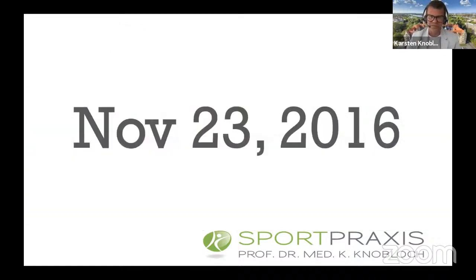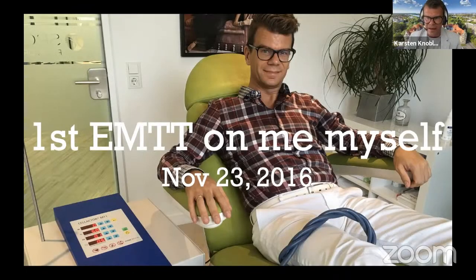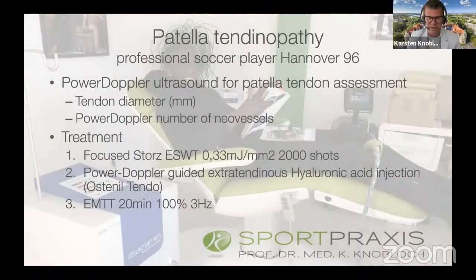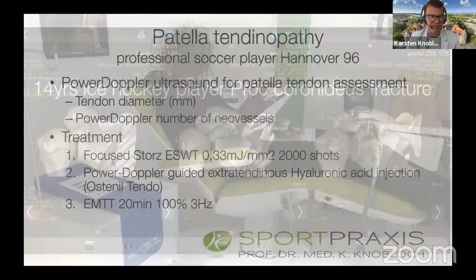So in November 2016, I started on my own the very first treatment with a pilot device on my knee. This was the first female soccer patient, 6 days after, with a patellar tendinopathy with the prior EMTT device, where I combined ultrasound-guided injections, focused shockwave, and EMTT for patellar tendinopathy.